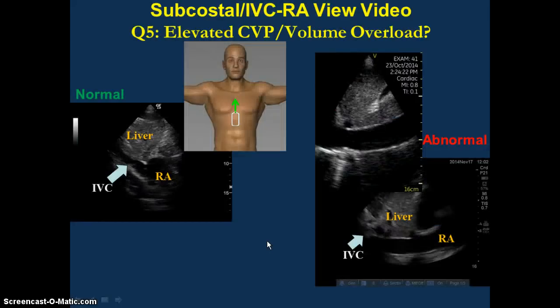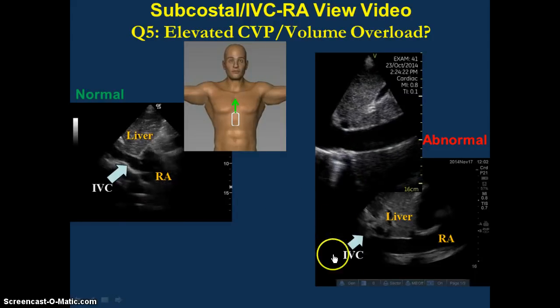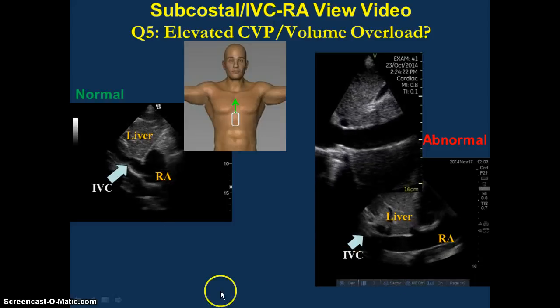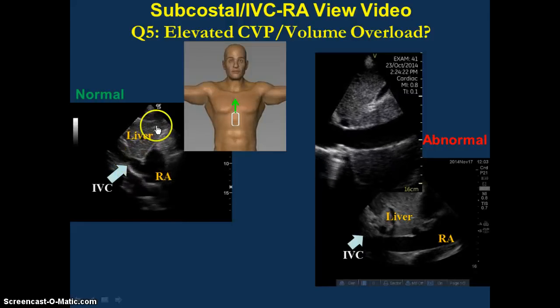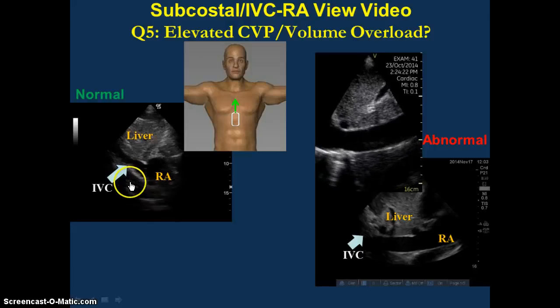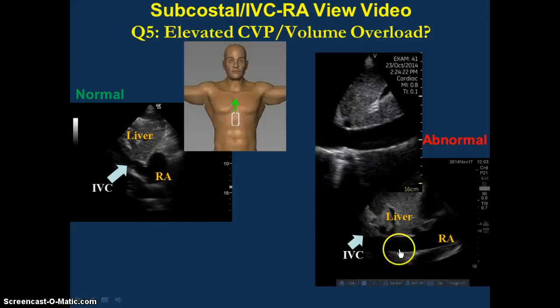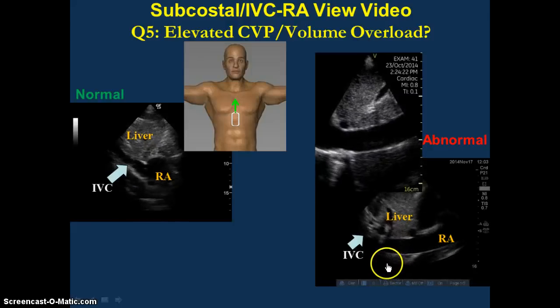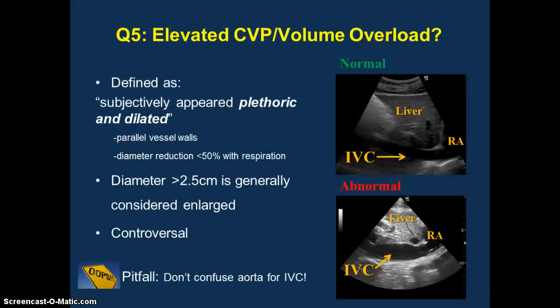Finally, we're going to move to the subcostal region to take a look at the inferior vena cava and the right atrium. A lot of people have put a lot of stock into looking at the IVC for assessing volume status and central venous pressures. I personally don't like that in isolation, but I think it gives you a lot of information when used in conjunction with the heart and the lungs. In general, we're looking at the size of the inferior vena cava as it courses through the liver into the right atrium. When it's relatively small and collapsible, it suggests normal volume status and low central venous pressures. When it is large and non-collapsible without changes during respiration, that suggests a high CVP or elevated volumes.